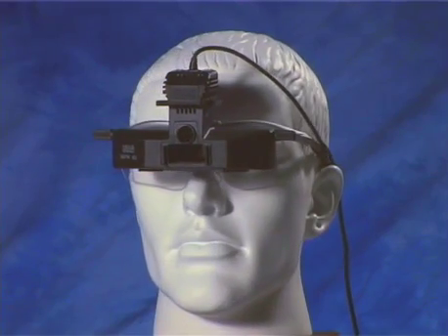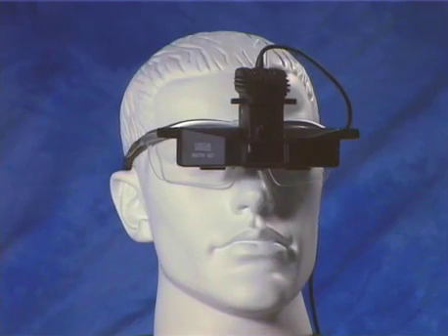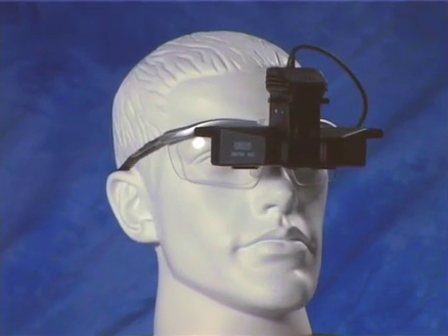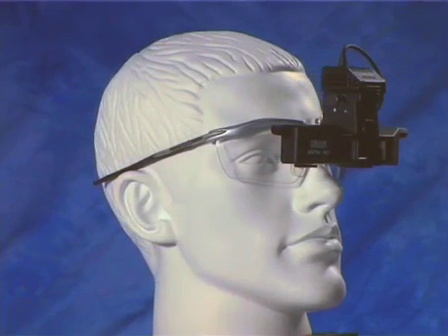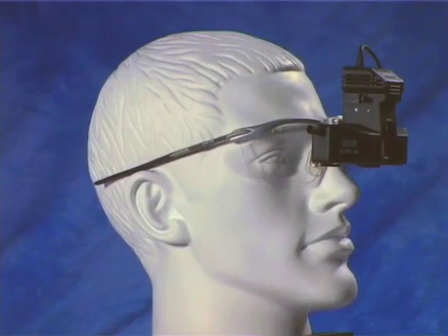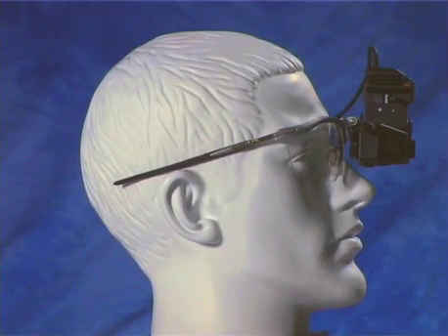For greater convenience and portability, spectacle-mounted indirects are also available. The lighter weight is achieved by having fewer core functions, principally light intensity and aperture adjustment. Their portability, however, makes them particularly useful for bedside and domiciliary consultations.